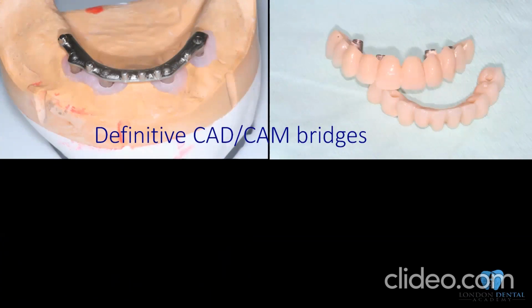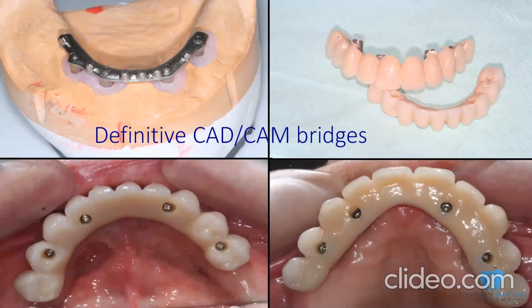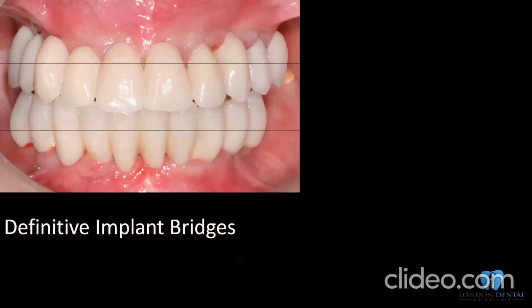As you can see, this is the framework, which is the definitive cobalt chrome framework. What we can see on the top is not composite, not acrylic, it is HPP from Redent. It's a very nice, strong material. It's as good as ceramic, and it's easy to maintain and easy to repair. They last quite long and are not that expensive. There is plenty of HPP material in the market. Please try to use them. It's a shock-absorbing material, very gentle, and it's easy to adjust if we need to.